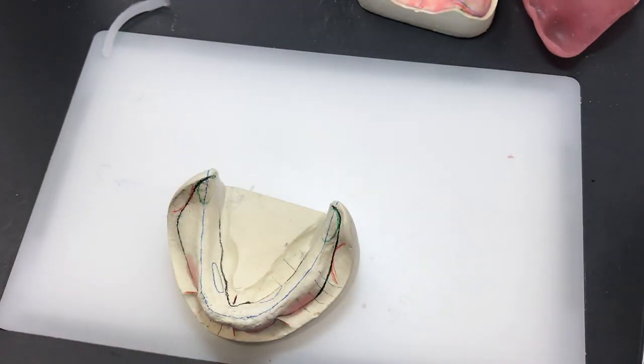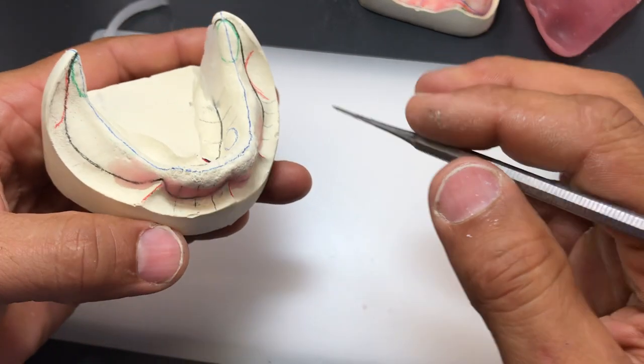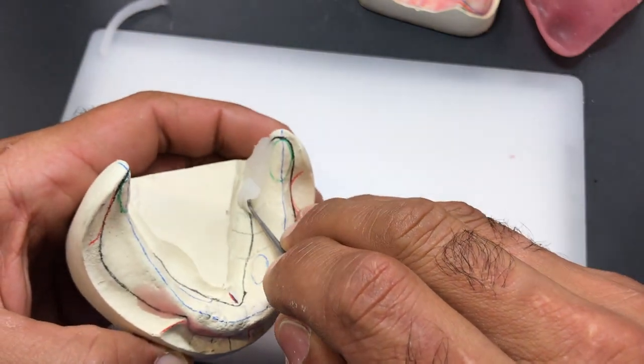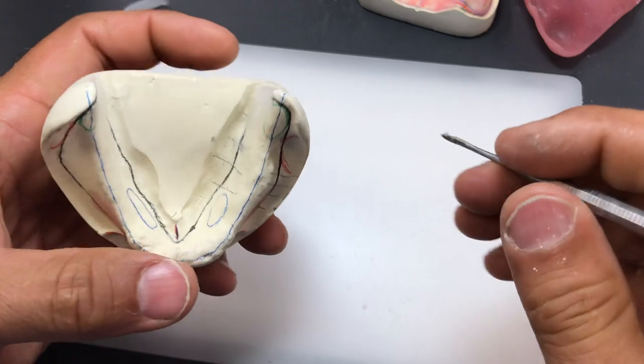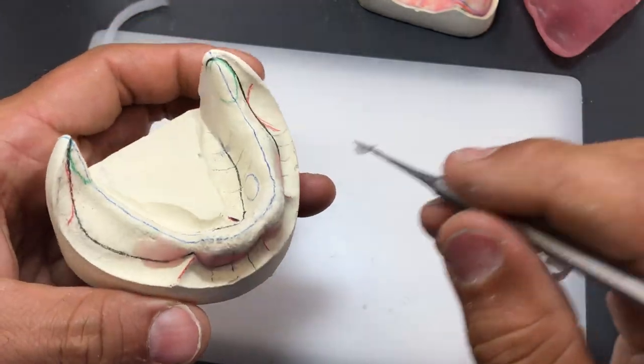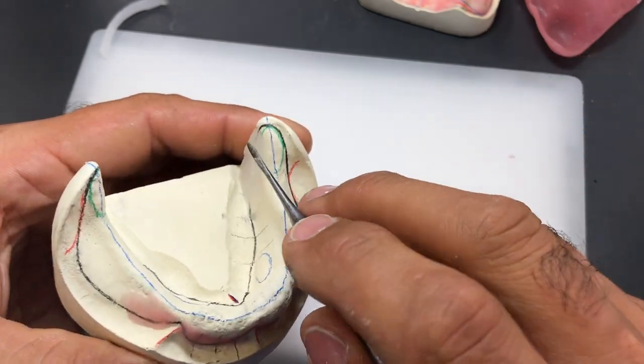Notice for this one, you don't need to apply any heat to your number 7 spatula because the properties of this wax are a lot softer. This wax has a lot softer physical properties than base plate wax. So I can just carve it without applying any heat to my instrument.